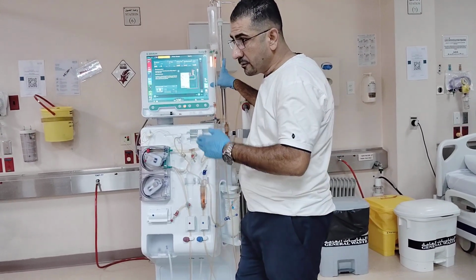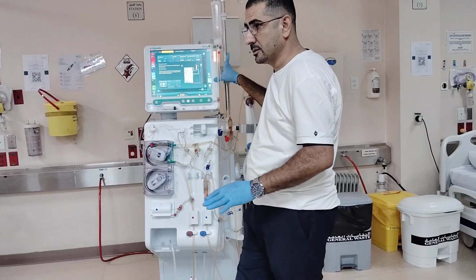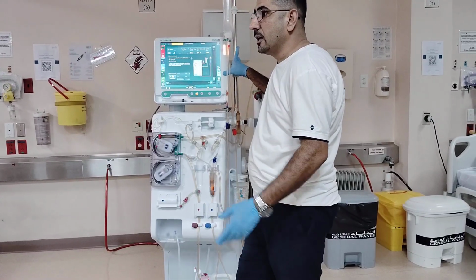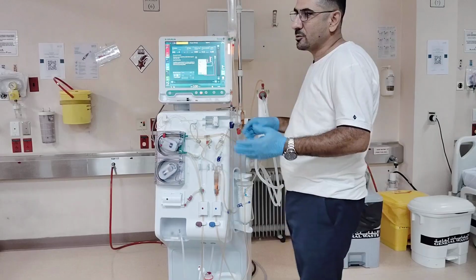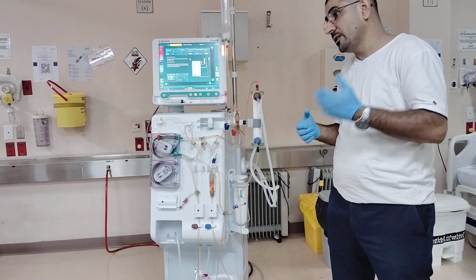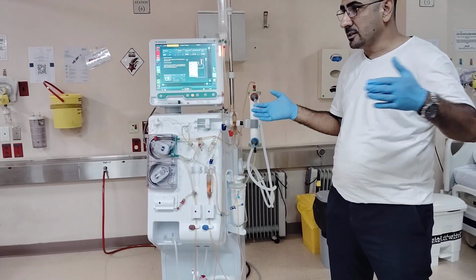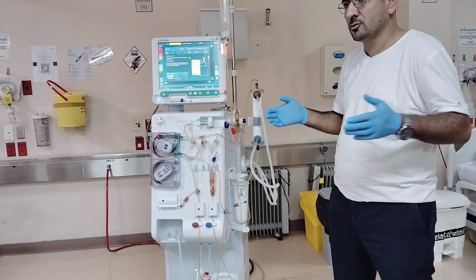For sure, you have to return the blood to the patient, to always keep the patient safe. And it depends from patient to patient, from case to case, it will be different. Because sometimes the clotting factor will be very high, or the hematocrit, the HB, so you cannot keep the disconnection time too long.